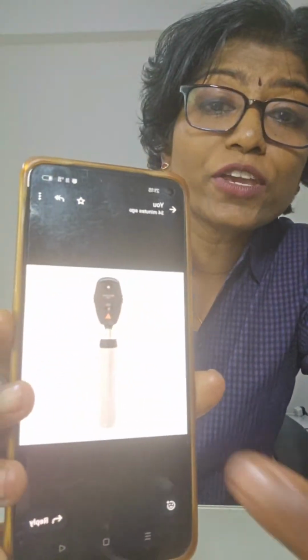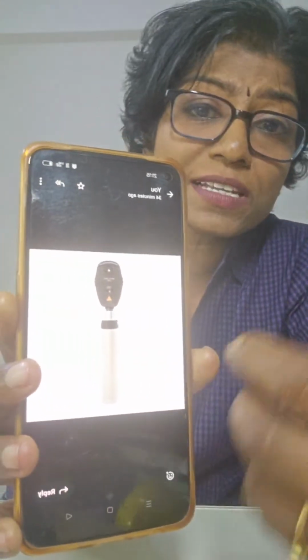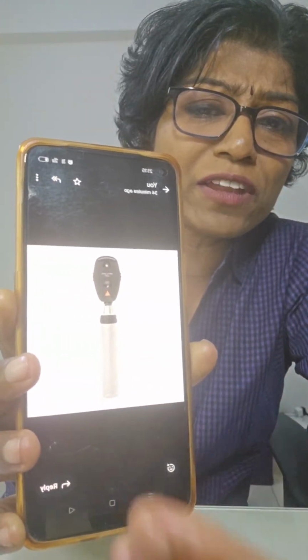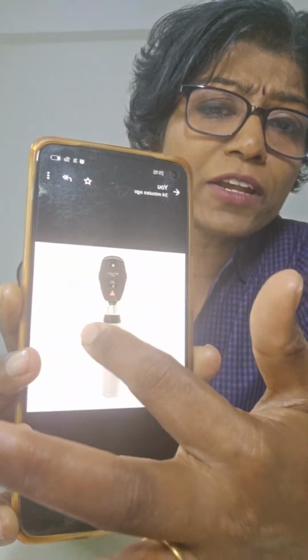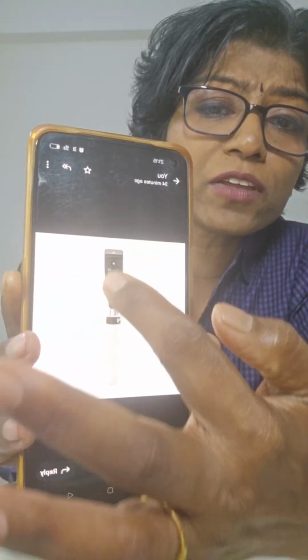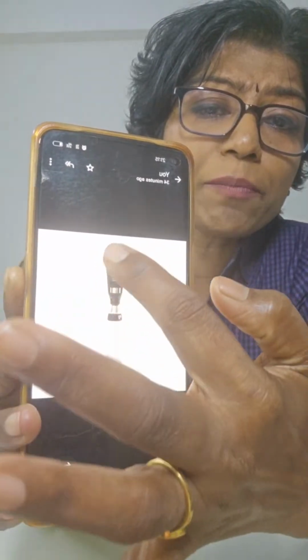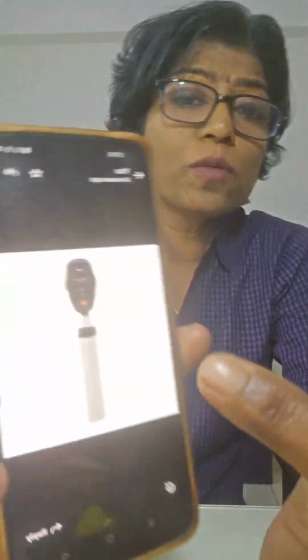Now, image seen on direct ophthalmoscope. So, direct ophthalmoscope is this one. Again, I'm showing you. Direct ophthalmoscope has a handle, so it is easy to use by beginners, for everyone. It's very easy, portable, and it's got a little round head compared to your retinoscope. Retinoscope heads are interchangeable, more rectangular and sharp, whereas the direct ophthalmoscope is a little rounded. And direct ophthalmoscope is a monocular instrument, we use only one eye to see.